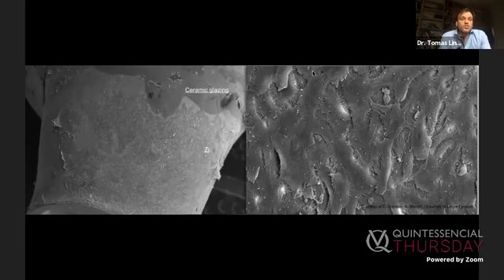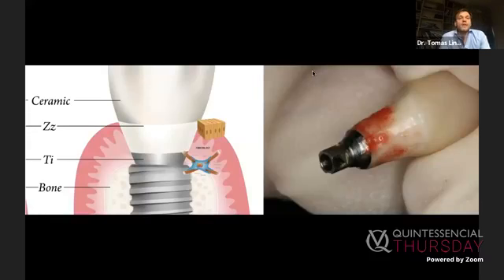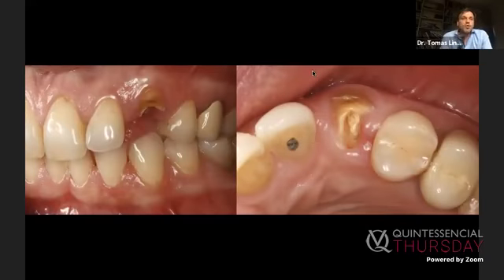And on the surface of polished zirconia, they did not find fibroblasts. They found epithelium, because epithelium is our protective cell. It lines the surface of zirconia and glues to it. That's why super polished zirconia, in my point of view, is better, because for epithelium, the smoother the better. Then it glues a little bit better. Let me conclude this topic with one of the clinical cases where we will see, in my opinion, the effect of super polished zirconia.